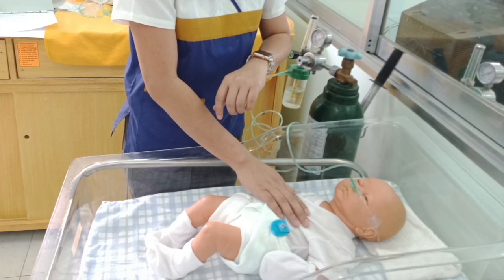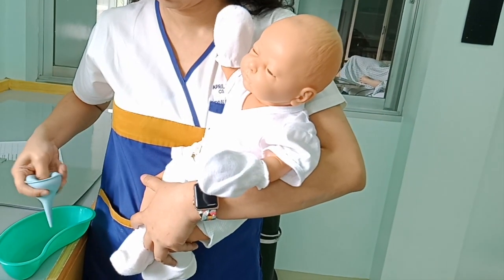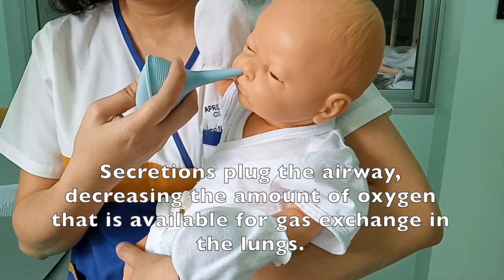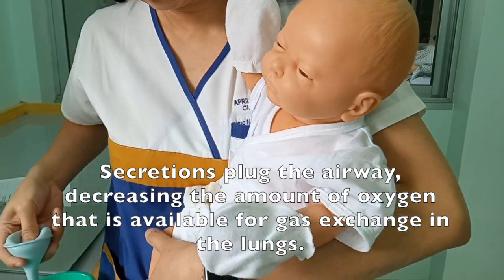Observe for patent airway and remove secretions by having the patient cough and expectorate mucus or by suctioning. Secretions plug the airway, decreasing the amount of oxygen that is available for gas exchange in the lungs.